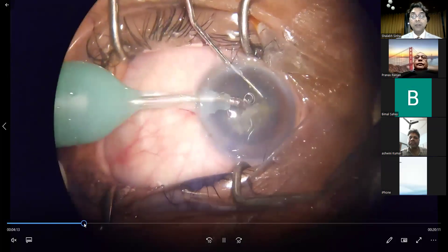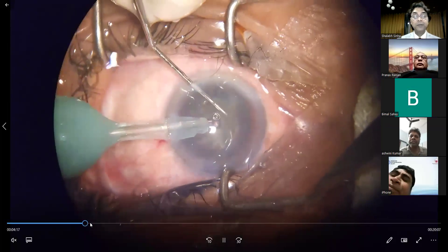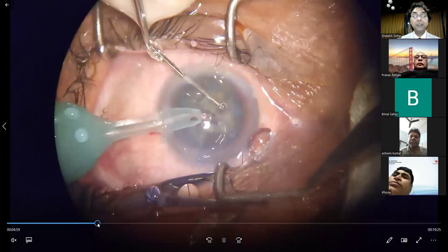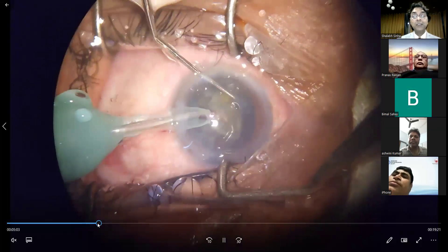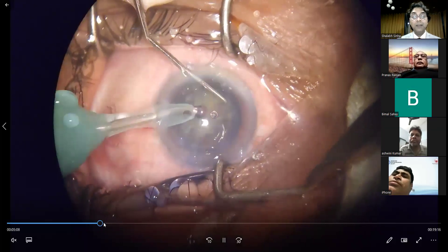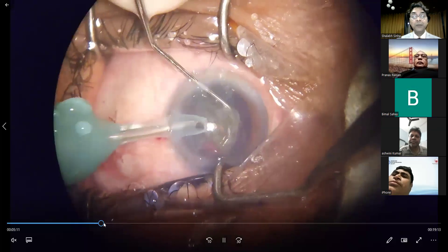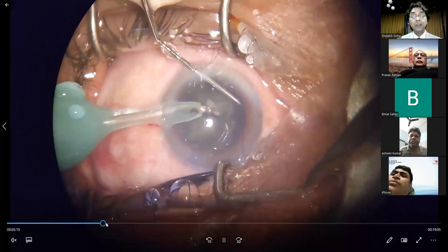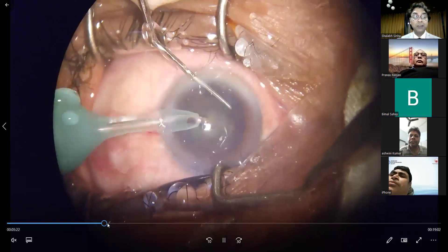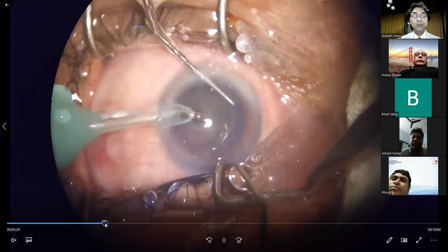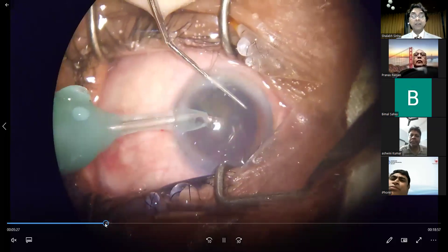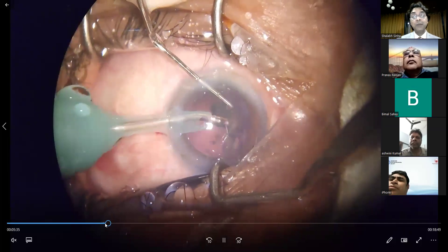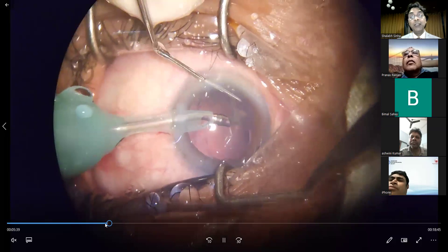A crack was obtained and the nucleus is divided into multiple fragments. Each of these fragments is then emulsified. If you have good separation of the various fragments, they tend to come into the tip, making it easier to emulsify. This is almost the last piece, and we are always told that one has to reduce the parameters and be careful while dealing with the last piece.